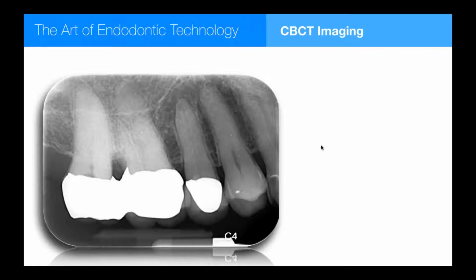This is an interesting case. This is the first time I started thinking that I should be taking CBCT volumes on all the cases I treated instead of the ones where I thought it was important. And I think most of us that get into cone beam imaging go through this process of finally understanding that the only way you can tell if you need a cone beam CT image is to take one, look at it, and see if there's anything that surprises you. And so that's a sarcastic way of saying you just need to take them in all your patients.